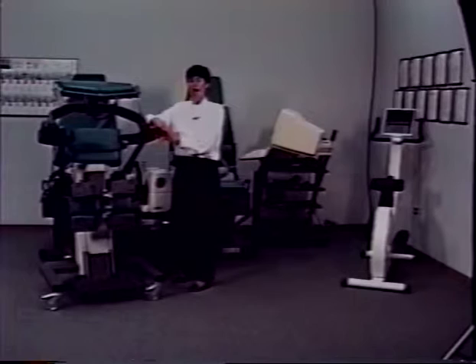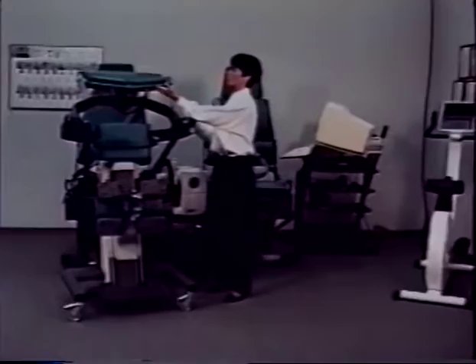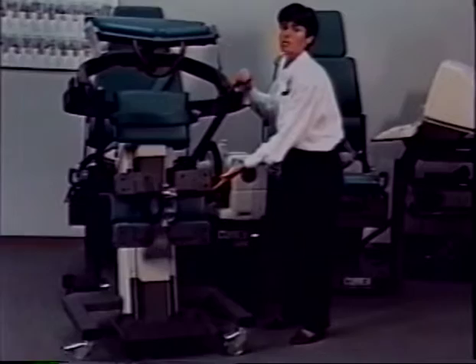The hallmark features of the TEF modular component are based upon thousands of hours of clinical research and clinician input from the standalone TEF unit. These features include the curved chest pad, superior stabilization including our patented three-point stabilization of the lower extremities, and maintenance of a standing position.